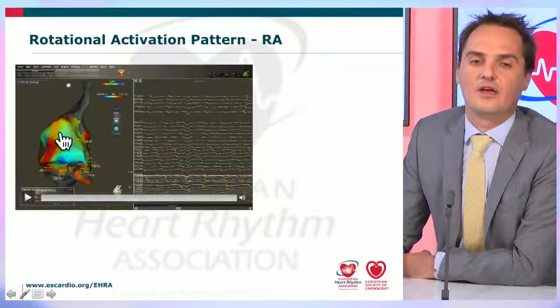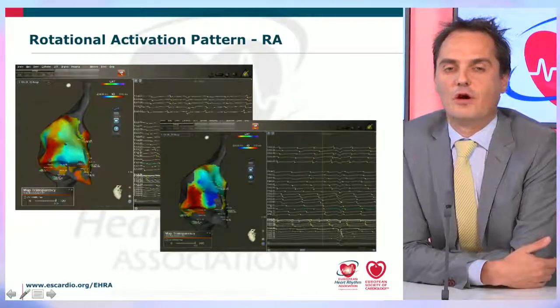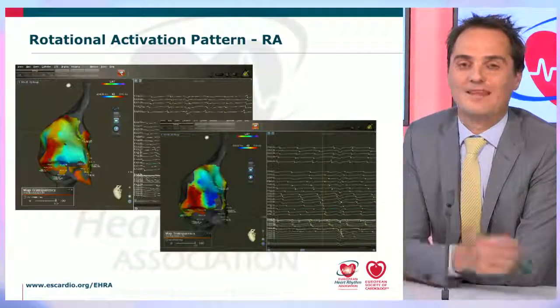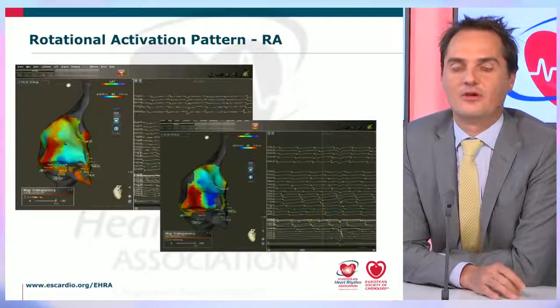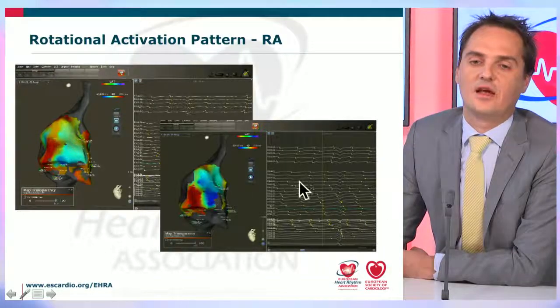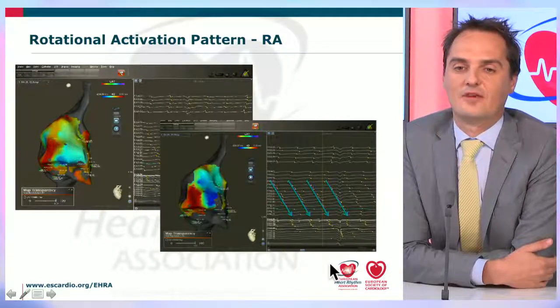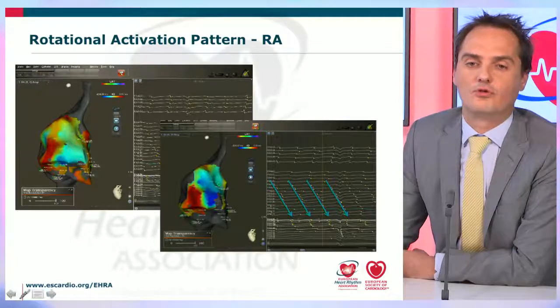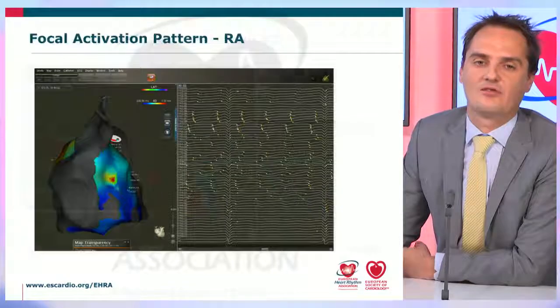Now it becomes feasible to say, show me the electrodes around this region, and let's have a look if, first of all, there are no artifacts, if we did not misannotate anything, and second, if we find exactly what Dr. Seitz has just shown you, a linear progression of activation, a linear sequence of activation. And it's exactly what you see here, of course. You see over these electrodes a linear activation sequence of atrial events that are not misannotated, that are not due to artifact. So we have strong confidence that what we are seeing here is an actual event, is actually happening.